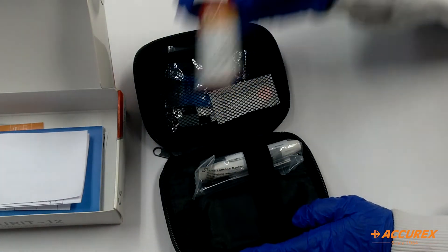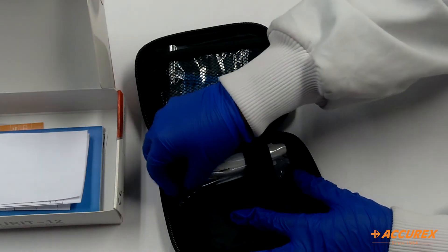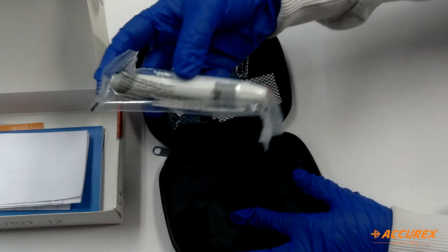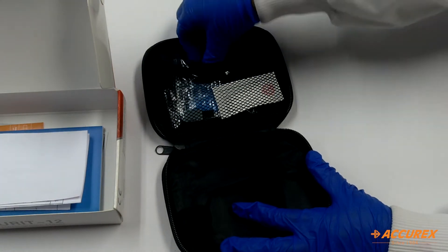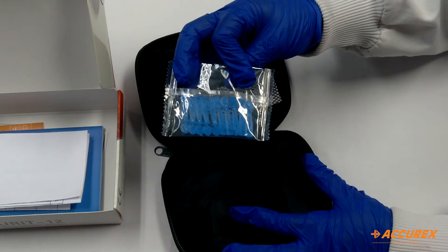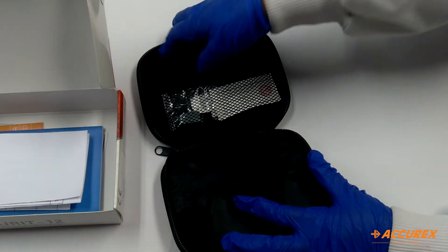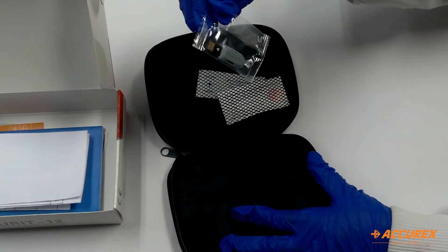This is the strips. Here is the lancing device. There are 10 pieces of lancets. And this is the code card.